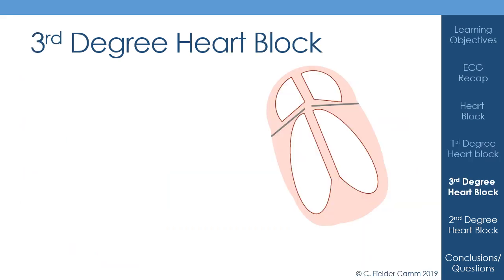And like I said, we'll discuss that in more detail in lecture 4. So I'm going to move on now to talk to you about third degree complete heart block. I appreciate that I've skipped second degree, but I will come back to it. I just think it's easier to explain third degree heart block before going into the slightly more complex area of second degree heart block.